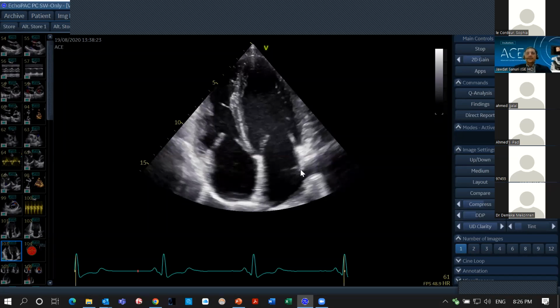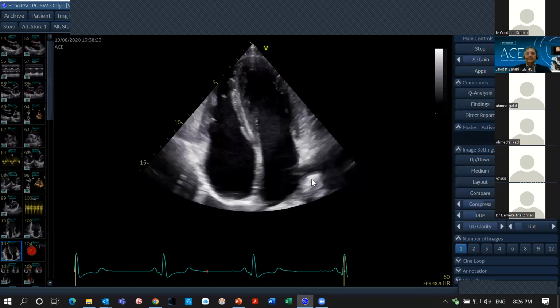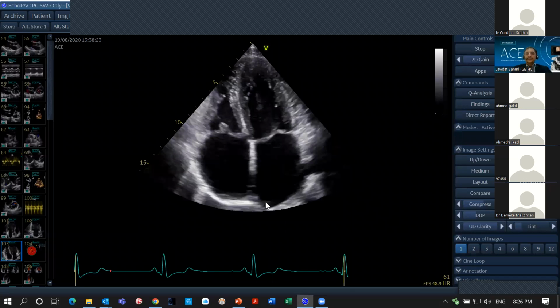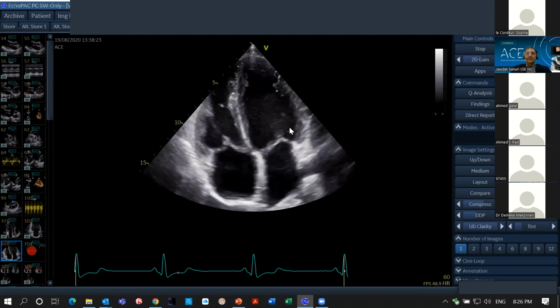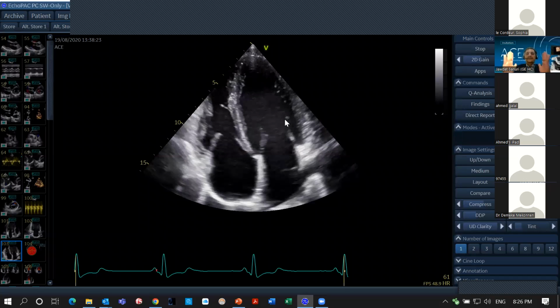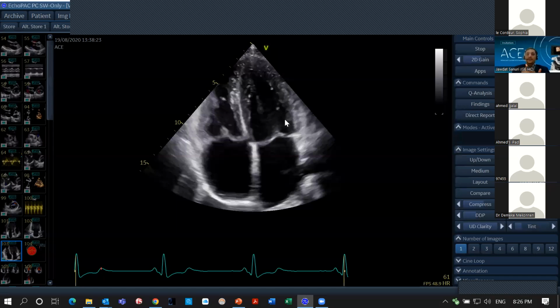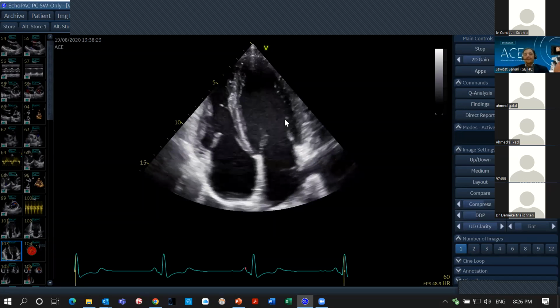If I'm focusing on LA, I can make this width much smaller to include only the LA. Or I can use 4D zoom prepare, which we mentioned earlier, where I have a zoom box around the LA or mitral or any structure, and then I have it in one direction, the other direction, which is 90 degrees, and then I acquire. Then I can decide how is my frame rate, is it sufficient or not if I'm doing a specific quantification. If I'm doing LV volume, then all I need is 12 volumes per second.